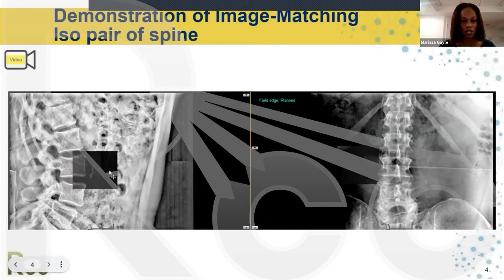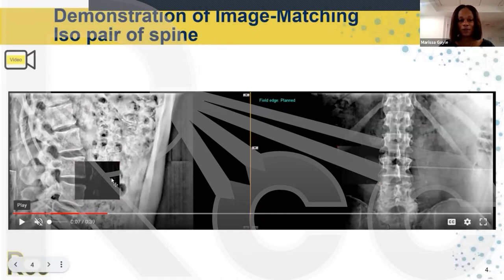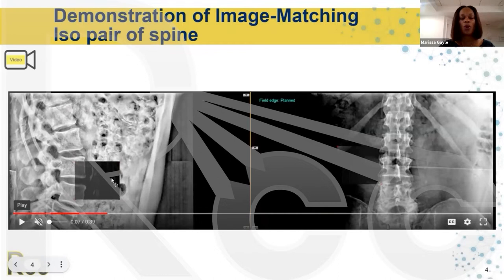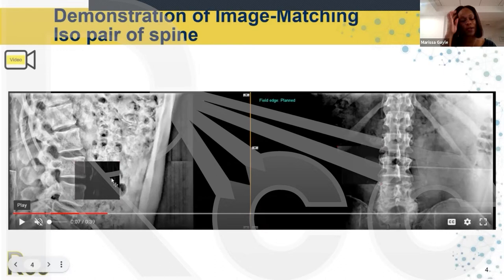You'll notice on the video there's a moving window. Everybody views their images differently. Some people like to use the moving window, some like the side-by-side, and some like it so that it wobbles. Whatever is your comfort and helps you see the images best is what you use.